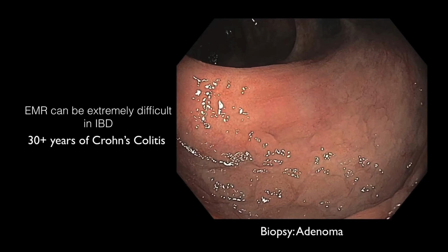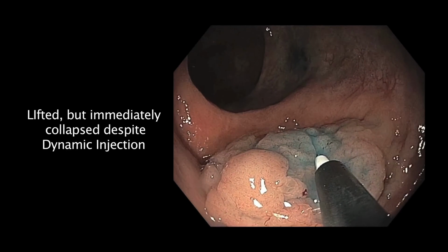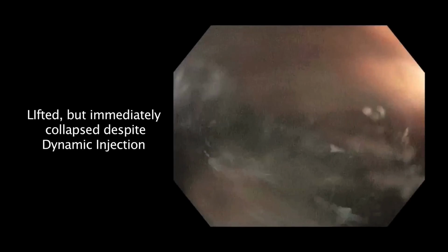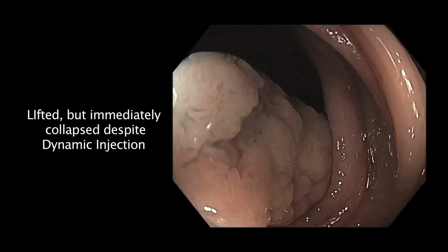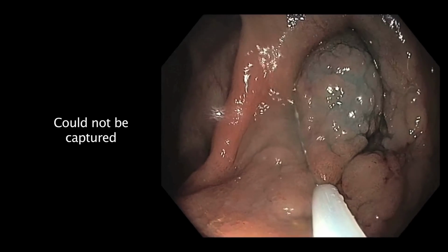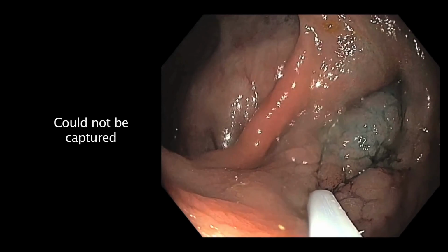The non-lifting properties of the nonpolypoid adenomatous lesion shown here in this patient with a history of more than 30 years of Crohn's colitis is a reflection of the difficulty encountered in the endoscopic removal of such lesions. Despite using a stiff snare, the lesion could not be captured for resection.